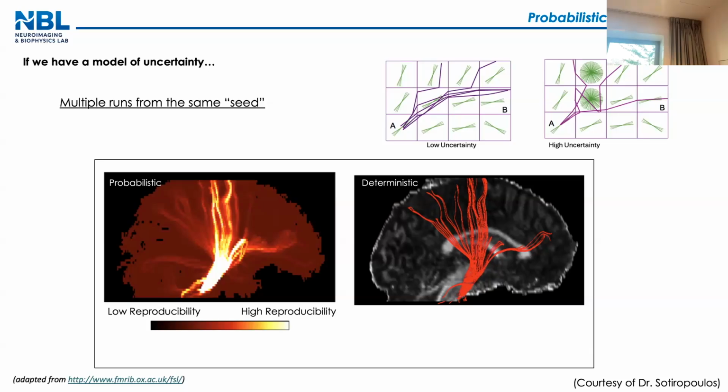Seeding from here, pretty much we are already reaching the whole brain. So if I use the tractography completely unconstrained, with a seed, I'm going literally everywhere in the brain. What I see, you can see the most reproducible trajectory, here's one going through the internal capsule, that somehow replicates what we see also with deterministic. The only difference is that probabilistic fills a little bit more, it is meant to fill gaps, okay? But at the same time, it's giving you a lot more false positives.